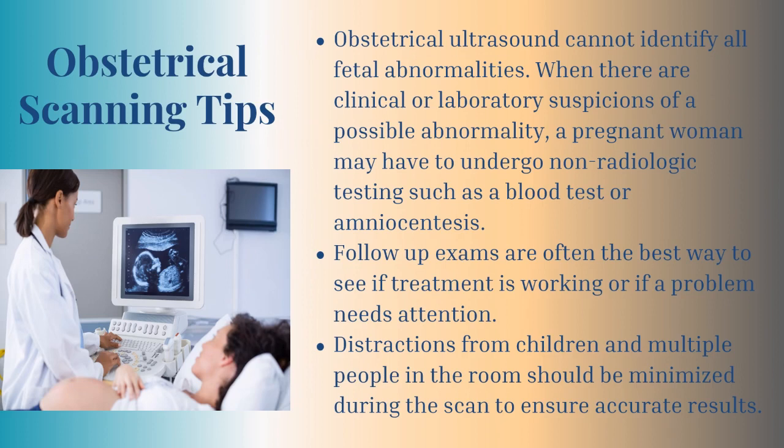Obstetrical ultrasound cannot identify all fetal abnormalities. When there are clinical or laboratory suspicions of a possible abnormality, a pregnant woman may have to undergo non-radiologic testing such as a blood test or amniocentesis. Follow-up exams are often the best way to see if treatment is working or if a problem needs attention. Distractions from children and multiple people in the room should be minimized during the scan to ensure accurate results.